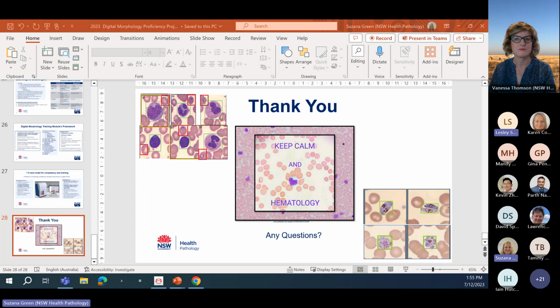Yeah, that's right. And then, what do you think, Vanessa? I think the software's got a lot of flexibility, Leslie. So I think there are different ways that we could use it. We could use it as a 20 slide set, because you have a library of lots and lots of different slides. So you could choose 20 slides that you'd want to give them. It could be 20 leukemias one time, it could be red cells another time. So there's lots of different ways that you could use it.